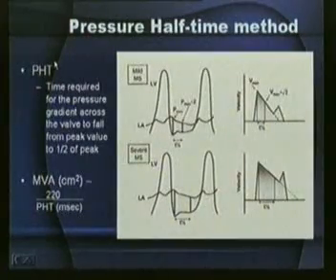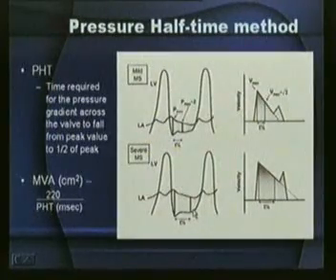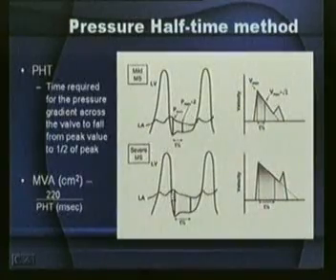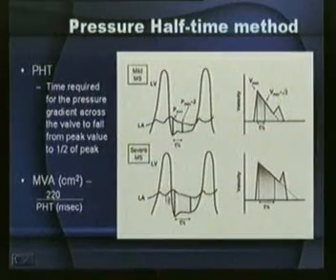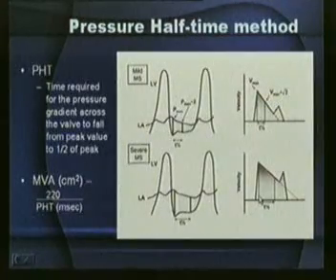Now if the patient's heart rate is not very high and is comfortable, you'll easily be able to make out between mild mitral stenosis and, look at the tracing below, that is severe mitral stenosis. As you can see in the cath study also, there is a large gradient between the LA and the LV. In real life, of course, you won't get an LA tracing, it will be the pulmonary capillary wedge tracing, which is an almost true reflection of the LA tracing, but you see the gradient, how nicely you will see, and similarly the echo echoes it beautifully.